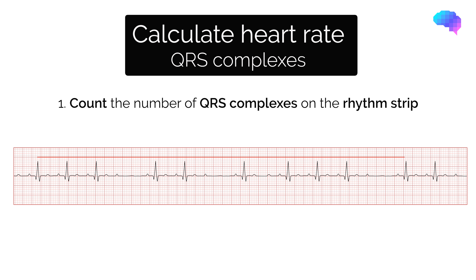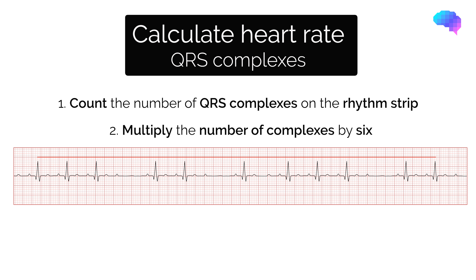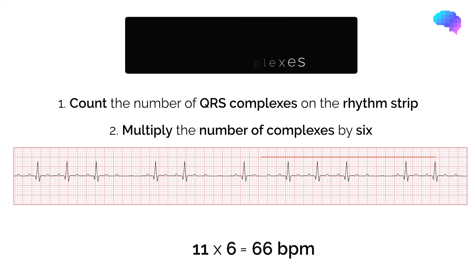Count the number of QRS complexes on the rhythm strip. After you've done this, multiply the number of QRS complexes by 6, giving you the number of QRS complexes within 1 minute. In this example, we can see we have 11 QRS complexes, therefore when we multiply this by 6 we get a heart rate of 66 beats per minute.